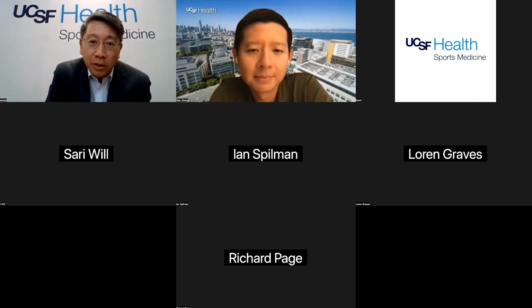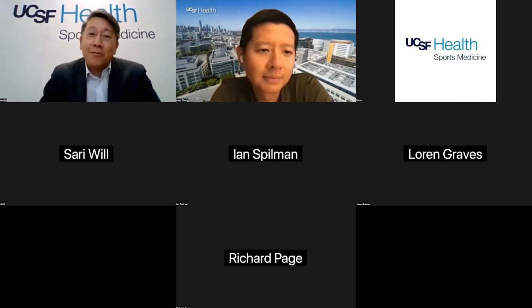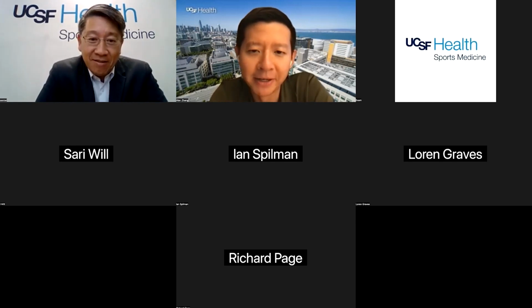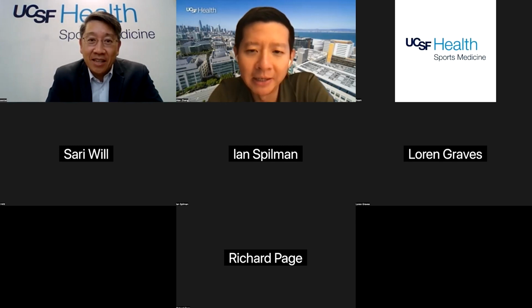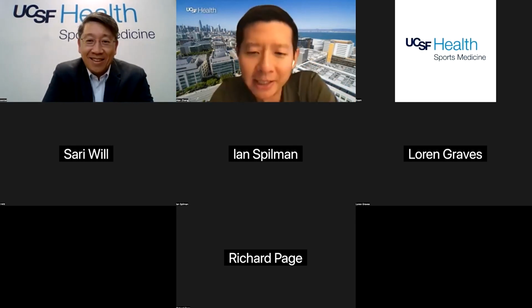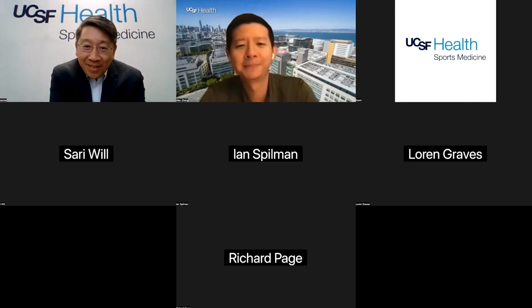Since you're a hip expert, we asked this earlier before, but when do you order a pelvic x-ray versus a hip x-ray? Yeah, so the pelvic x-ray usually includes both hips and the whole pelvis. So we usually start with that because it's good to compare one side of the hip to the other one. But the specific hip x-rays, there's various views, like the side view of it. We'll usually order an AP pelvis, and then also a lateral of the hip that's being investigated. So we'll do both, actually.